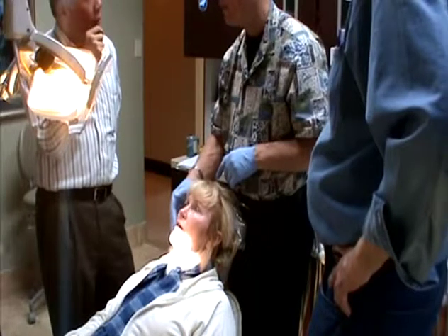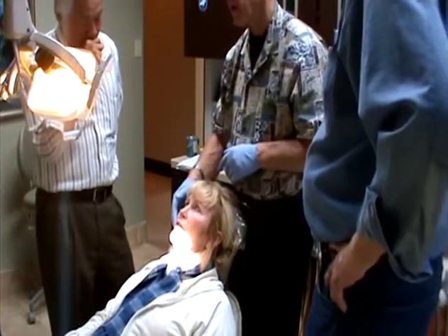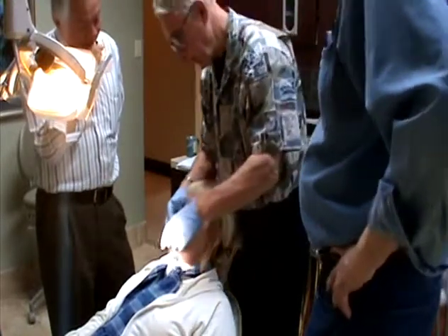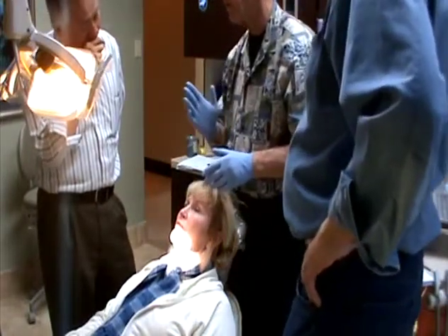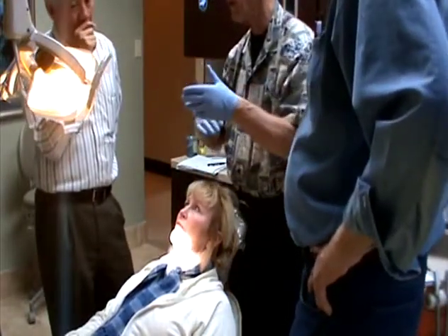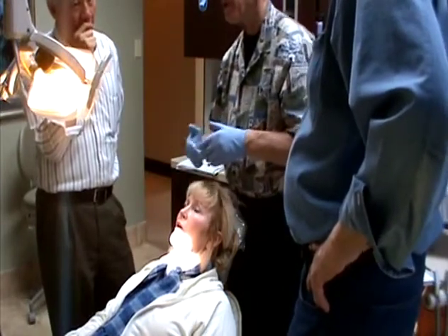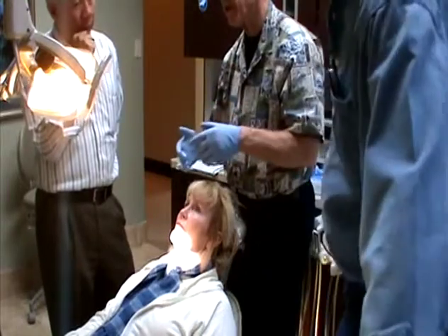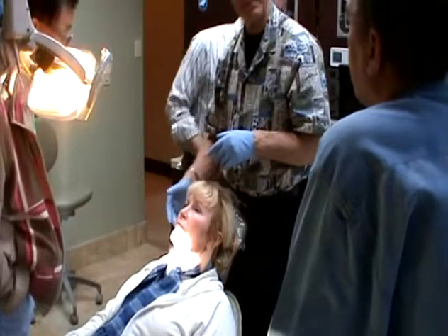Does it need to be a square wire or can it be a round wire? Round wire. Like a stainless steel one? Yeah, because it's hooked to these bicuspids, so you're not going to lay the molar over. Right, you're not going to lay that molar over, you're going to pull that molar straight up. And you do that, and you keep wearing the elastic, and you keep increasing that up bend until that molar touches up here.